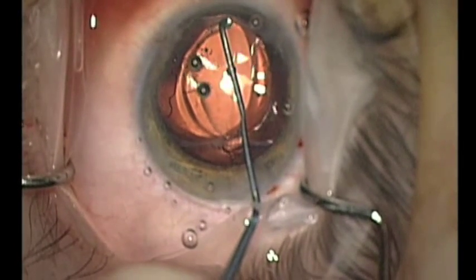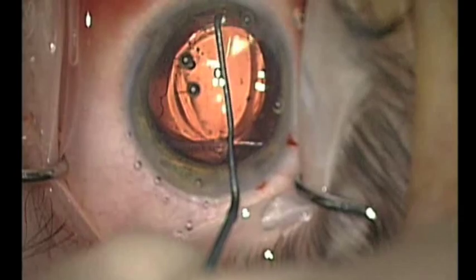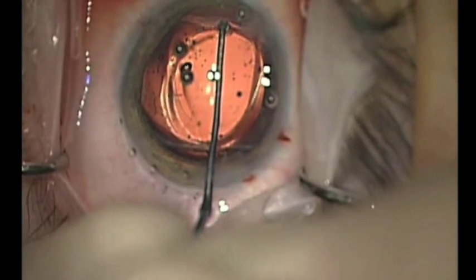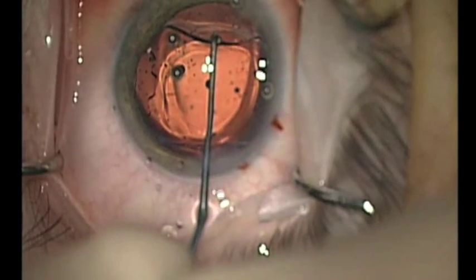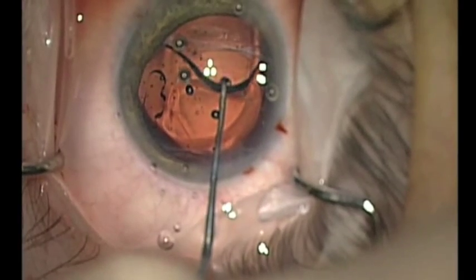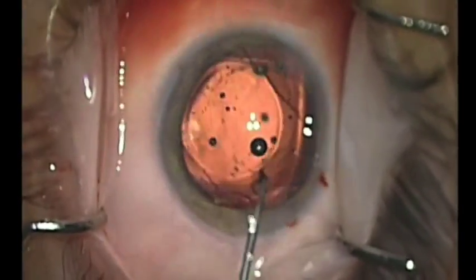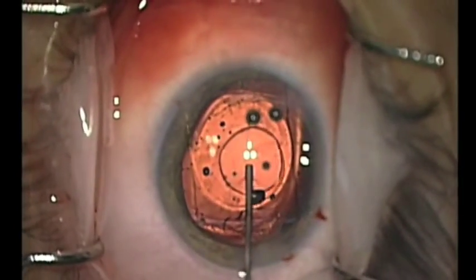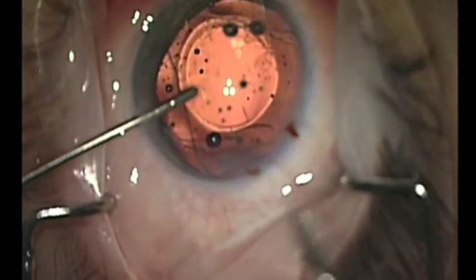Here in slow motion, you can see that the undulation at the tip of the mushroom tip is under the intraocular lens and beneath the anterior capsule. Force is then placed directly at the equator so that each plate haptic can be easily manoeuvred outside the capsular bag. Here more cohesive viscoelastic is inserted in order to deepen the anterior chamber.